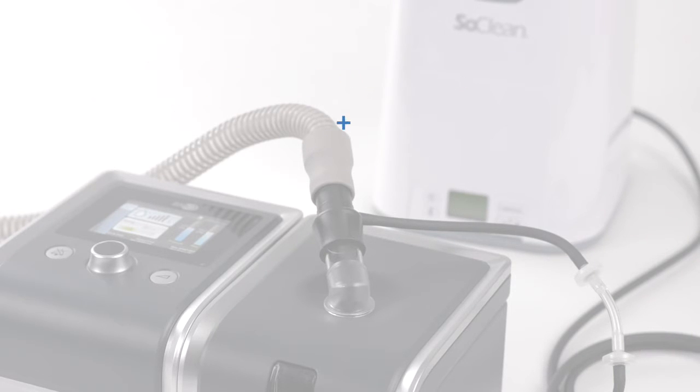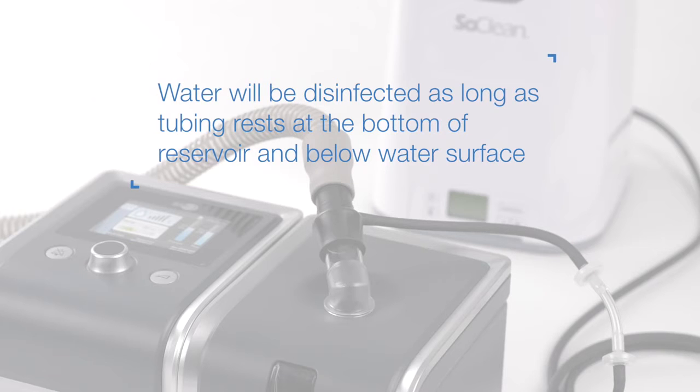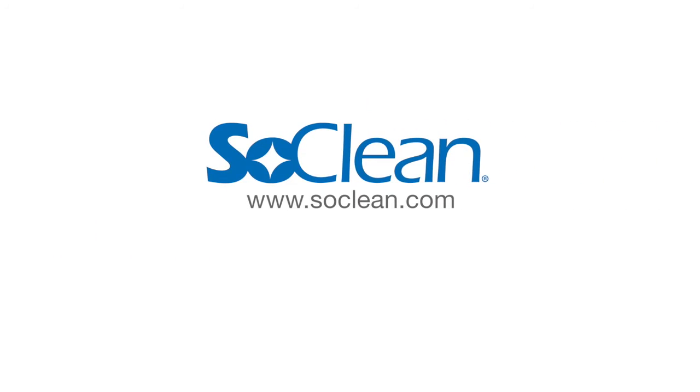The SoClean will disinfect any water in the humidifier reservoir as long as the end of the injection tubing rests on or near the bottom of the reservoir and below the water level.